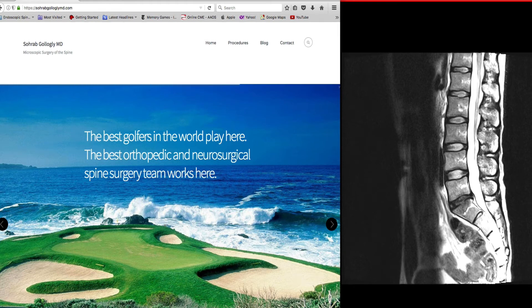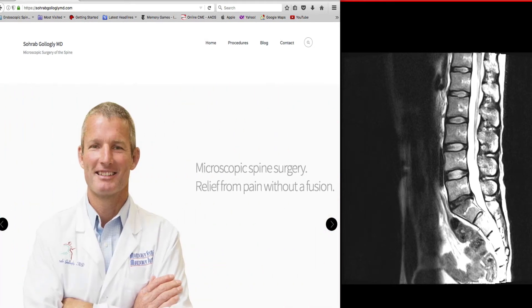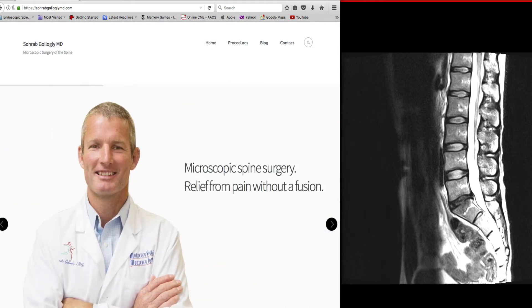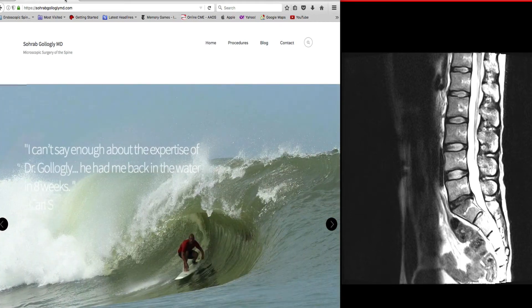Hi there, this is Dr. Gallagly in Monterey, California. This is one of my ongoing lecture series on interpretation of MRI scans of the cervical and lumbar spine.